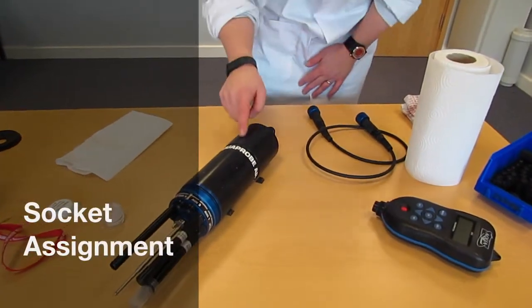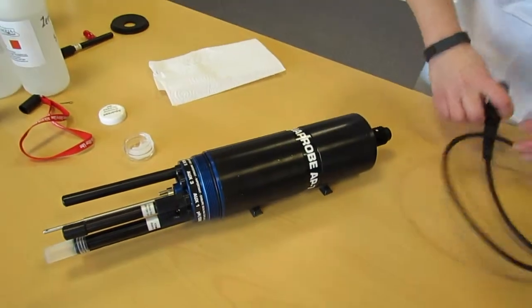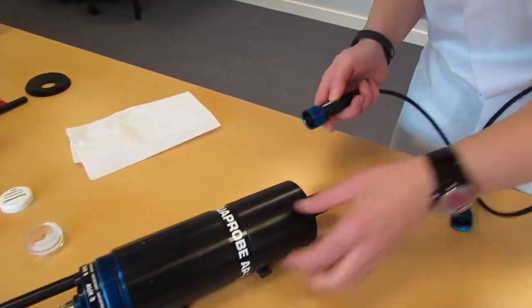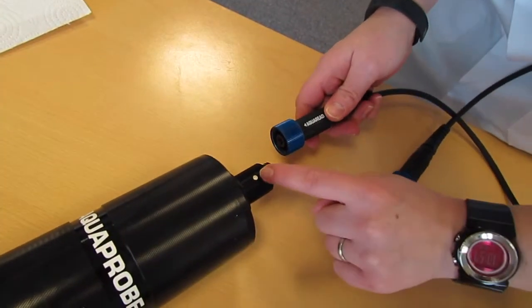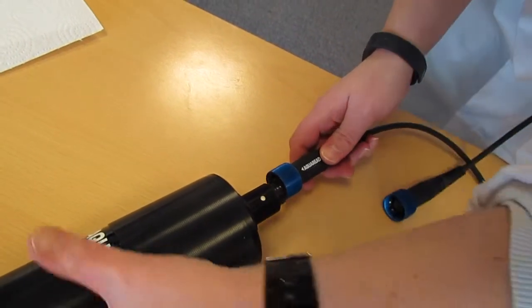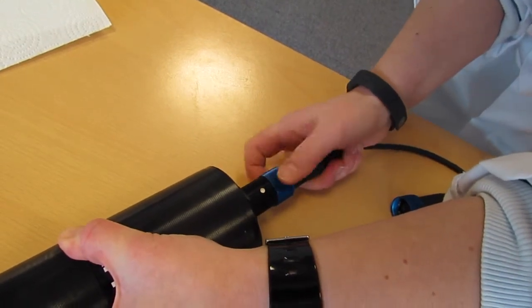Now we need to tell the probe that it has the turbidity electrode installed into the AUX1 socket. We take the lead and connect it to the probe. The aqua-read symbol must be facing up and it lines up with the white dot on the probe. Push this firmly into the probe and screw down the blue collar.